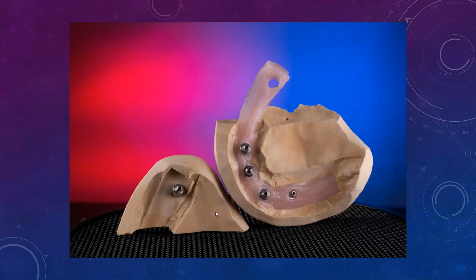And let's say, for example, something like this happens, right? Where I broke a model and I need to use that verification jig to fix things. You basically would do this for the same thing. Like if in the mouth you had to reconnect it and adjust the model, the steps would be similar to this except for the gluing the base part. So if I just simply glue this model together, obviously it's not going to be passive, right? Because glue has certain thickness and everything else, and you want to make sure your models are completely passive.